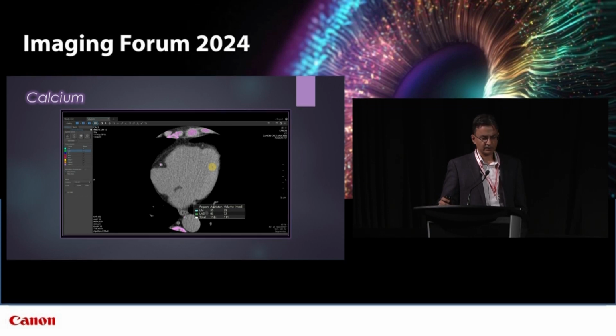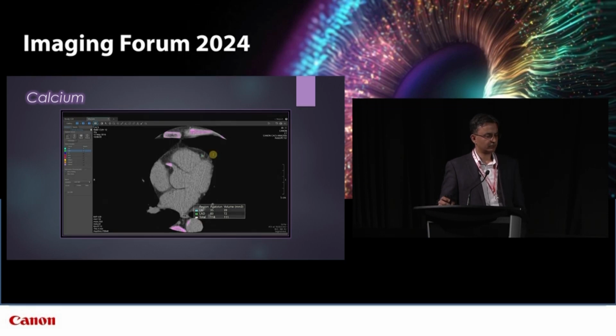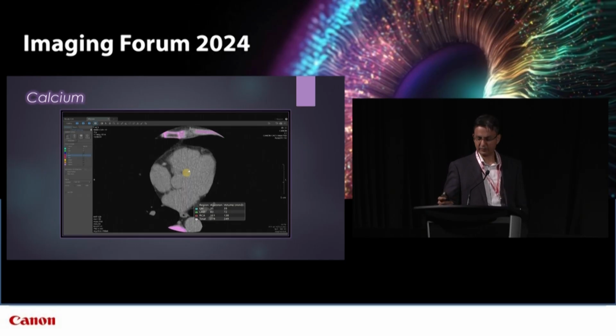So here's a typical example for coronaries. You can see we start with the finger tool, hit the RCA labeler, and after one click, one second, the software is able to segment out the calcium both in and out of plane in the z-axis. So fairly routine, easy, and you get both an Agatston and a volume score from that.